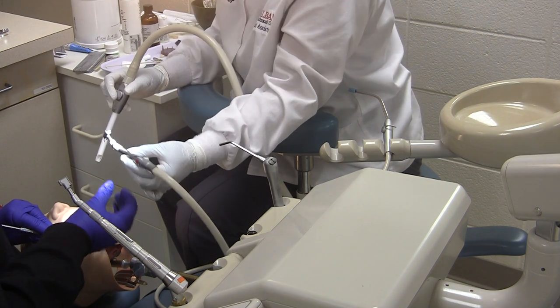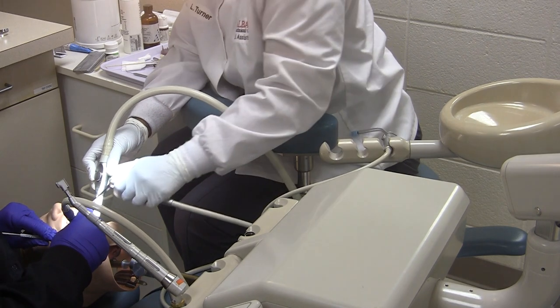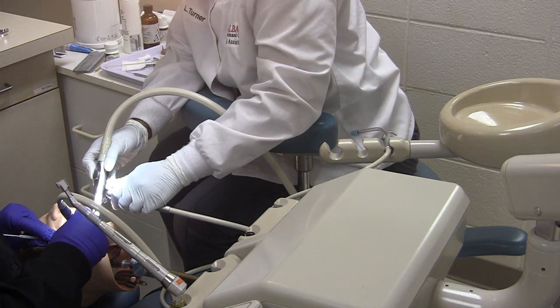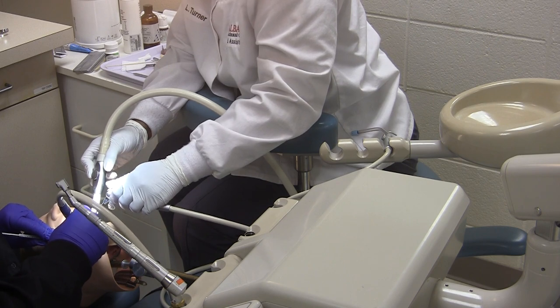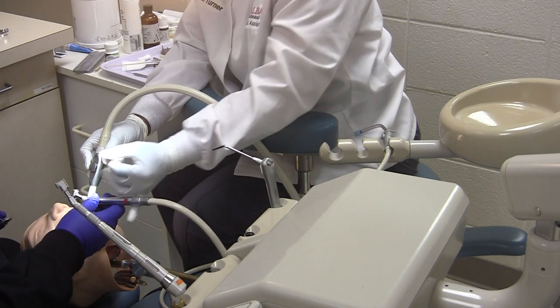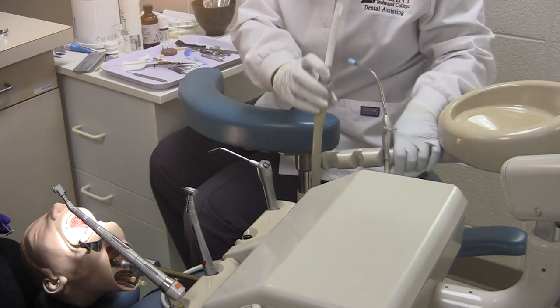Pass the high speed handpiece and grab your HVE suction and air and water syringe. During this portion, you may be asked to change burs or pass another instrument.